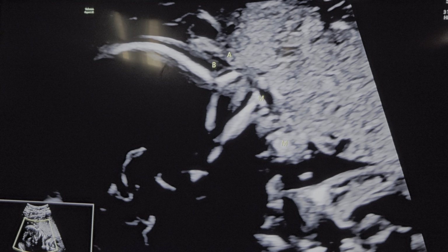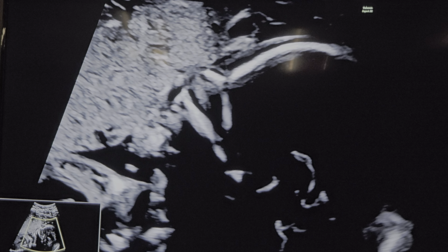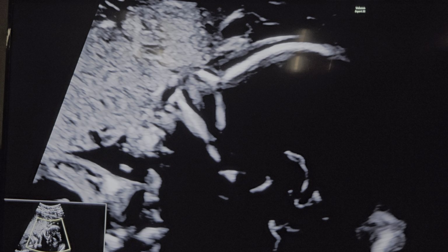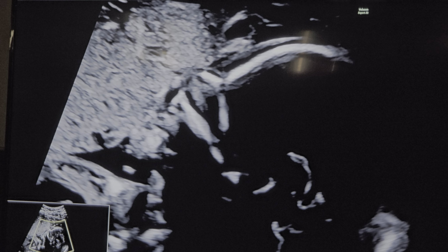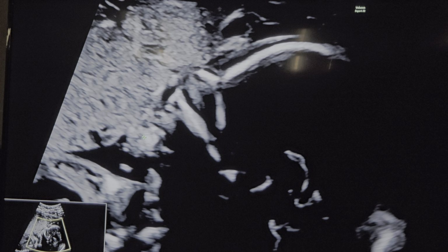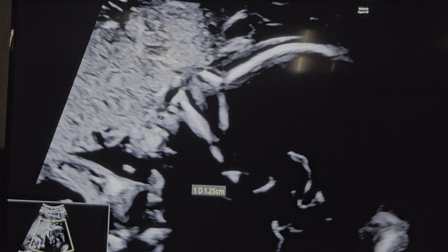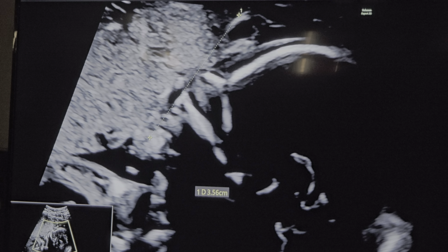Okay, so we will go back now. You are seeing the mid-sagittal view of the face, correct? Is this view clear now? In this view, concentrate on the mandibulomaxillary line. This is the mandible. Is this point clear? You saw the tip of the maxilla? So did I extend this line now?